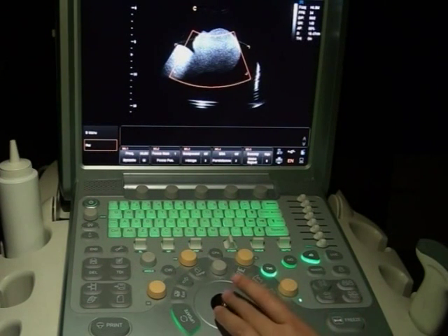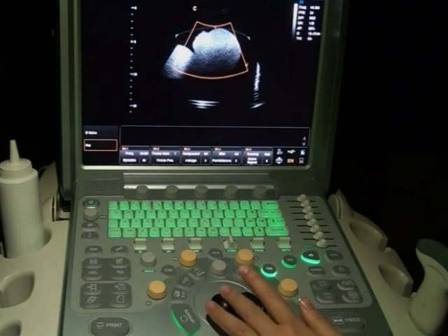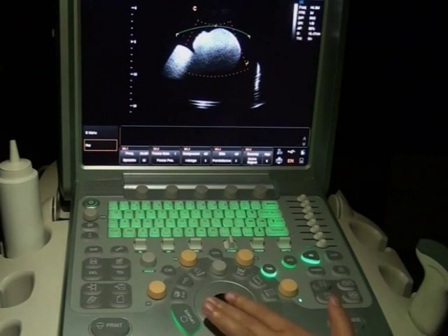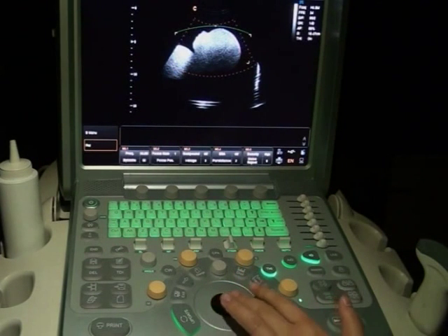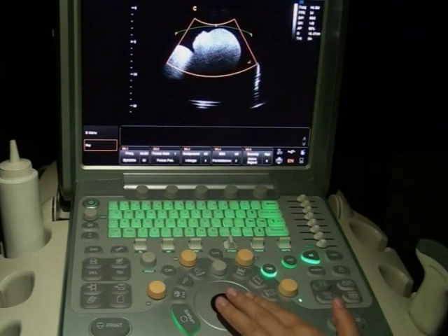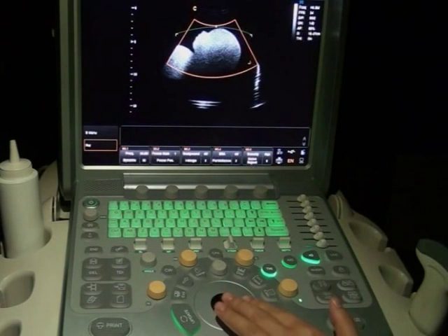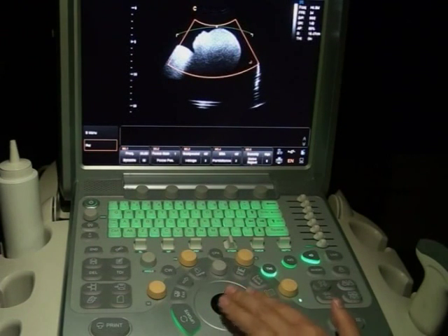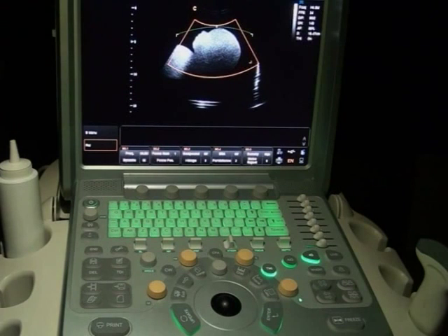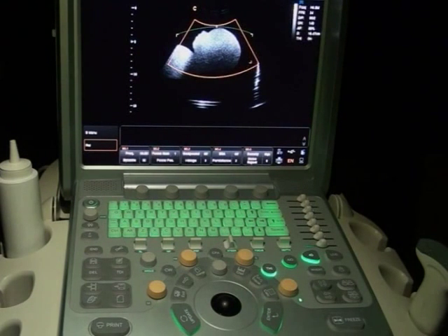Use the Enter key and trackball to adjust the size of the region-of-interest box and move it to the right position. The size of the box should be appropriate — not too small and not too large.